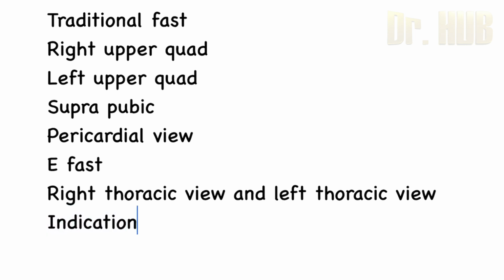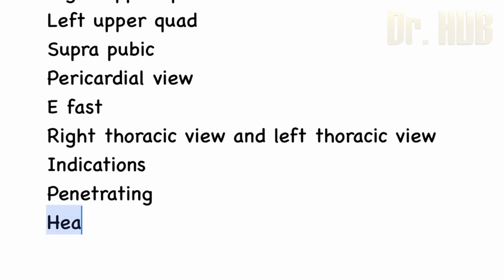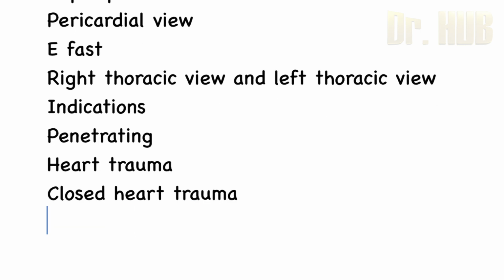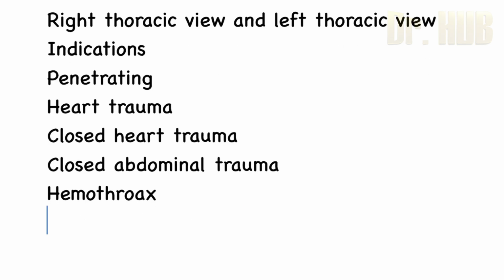So what are the indications? The indication is penetrating heart trauma, which can be seen. There can be a closed heart trauma, which also can be seen. There is closed abdominal trauma and chest trauma, pneumothorax, as well as hemothorax.